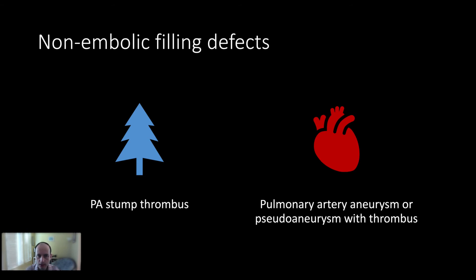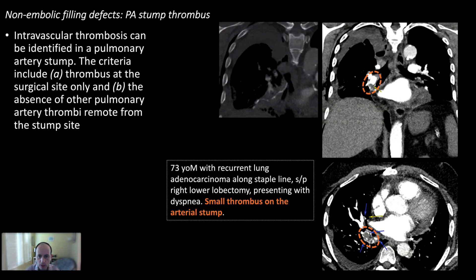In patients who have undergone lobectomies, there will be a stump of the pulmonary artery right above the staple line. A filling defect within this stump — called stump thrombus — is not a pulmonary embolus and does not require anticoagulation.